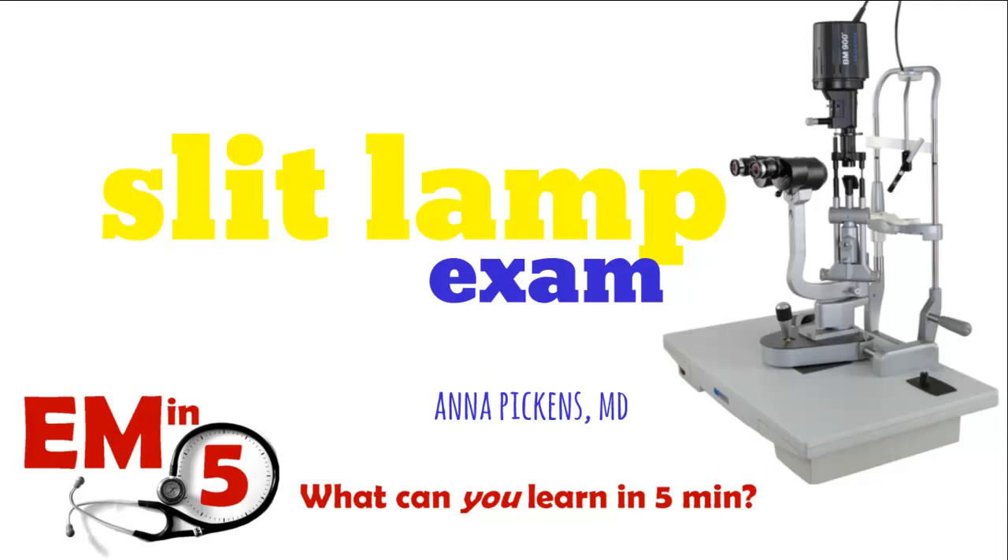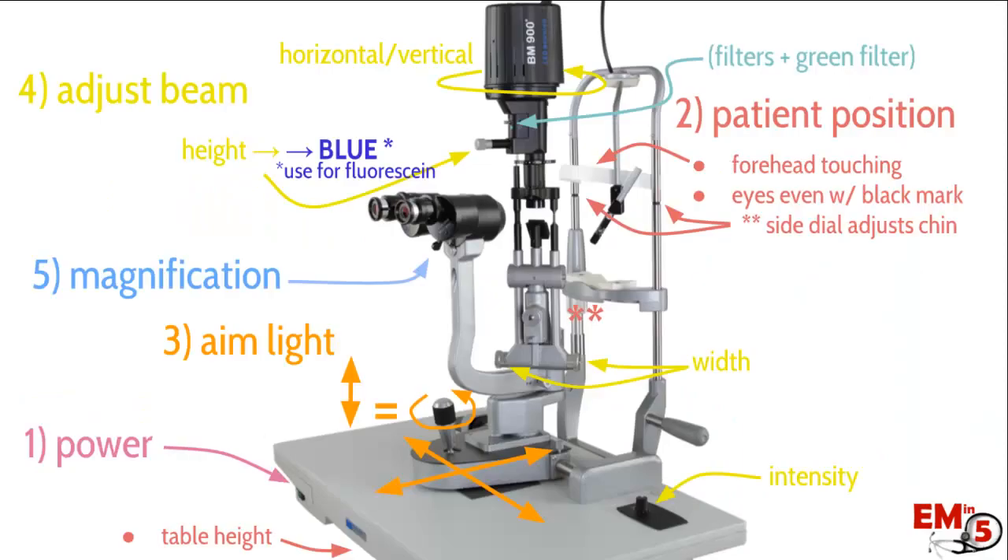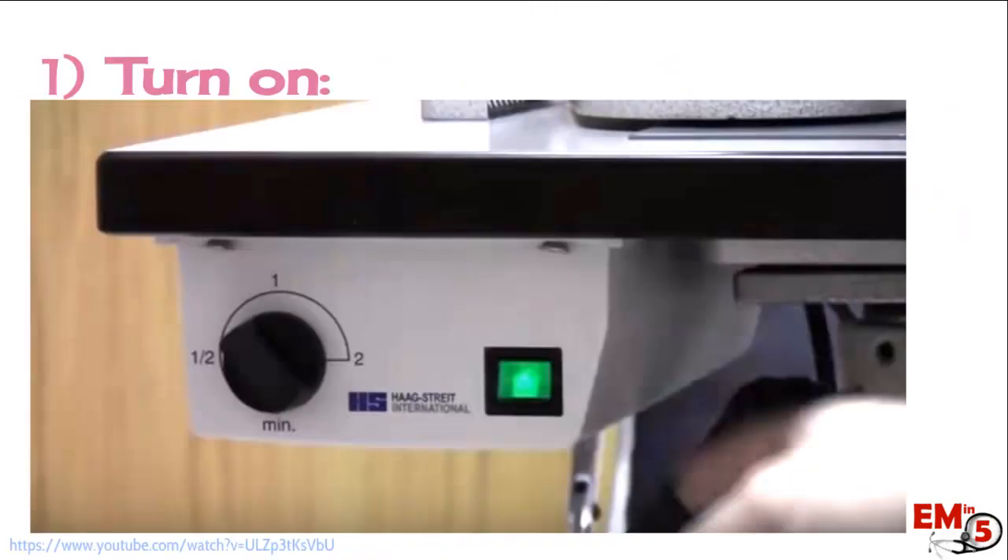This week for EM in 5, I'm going to go through the anatomy of a slit lamp exam. It's kind of a tricky machine to use sometimes because there's tons of dials. They're not always intuitive, but it's a really helpful machine, so it's good to know how to use it. So let's start with the basics.